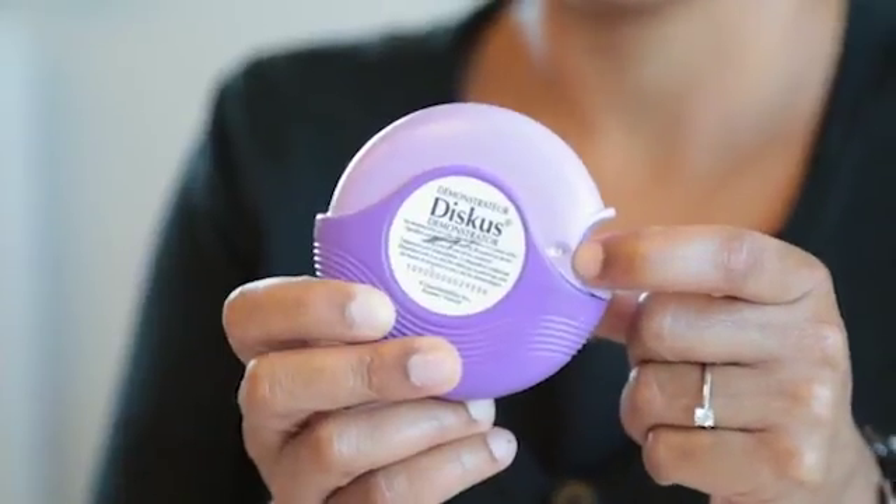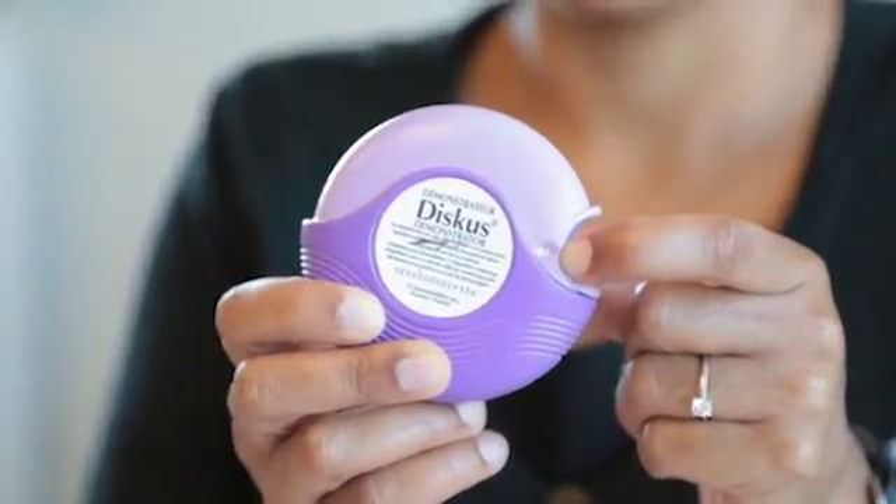On the front of your discus there is a counter. It will go down once each time you use it. When it is completely empty, you will see a red zero.